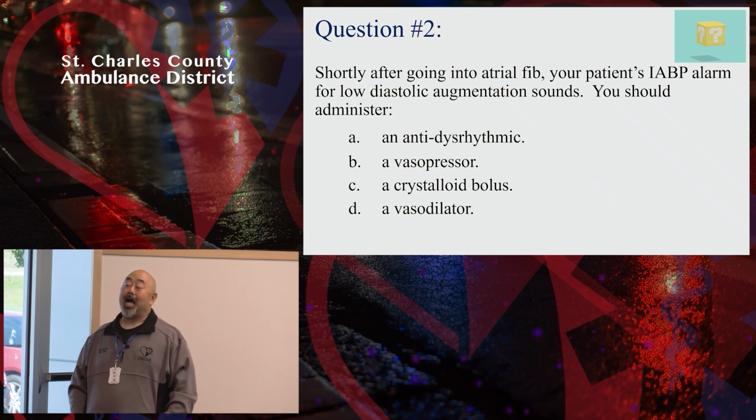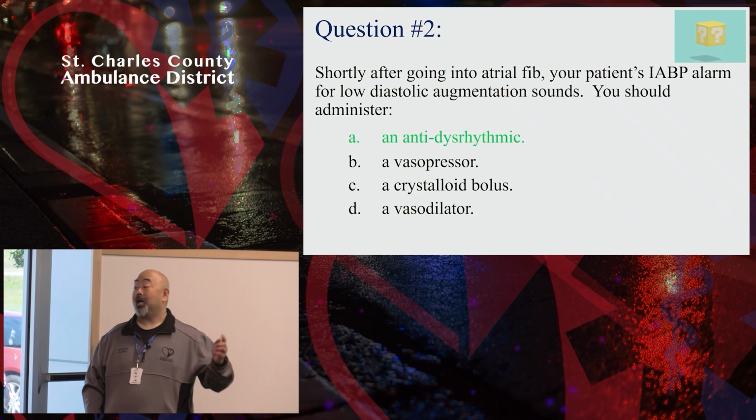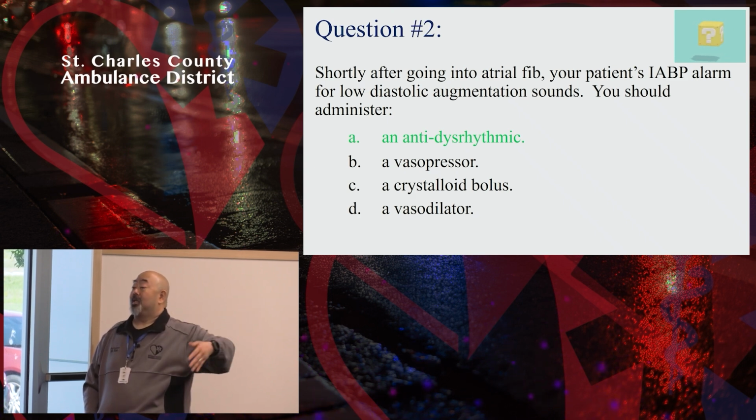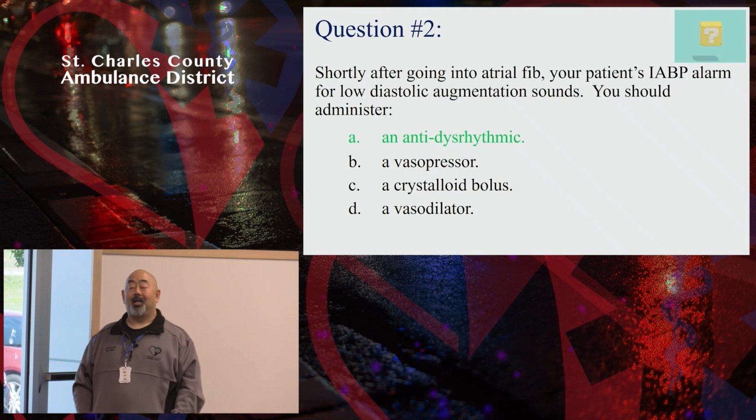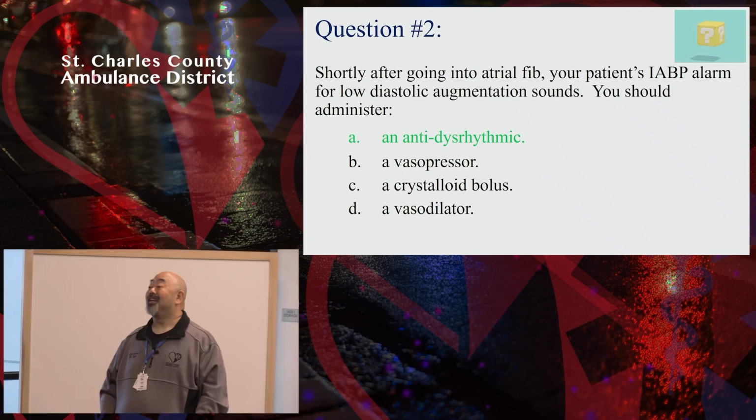I was hoping you would say A, because if you can convert them back into normal sinus rhythm, then the dicrotic notch comes back on and the timing gets better, augmentation is more consistent, and then that alarm goes away. I wouldn't necessarily pause it though.